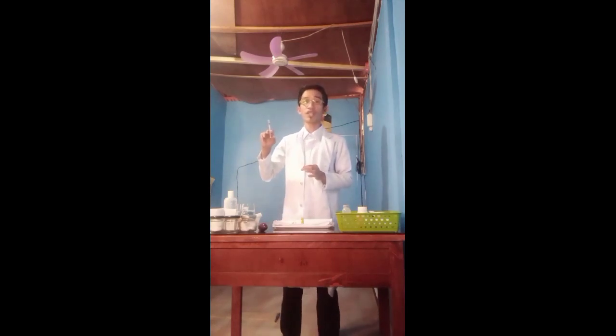This allows fluid to settle at the bottom of the barrel so it is not expelled. So next, if the syringe contains excess fluid, use the sink. Hold the syringe vertically with the needle tip slanted slightly toward the sink. Slowly eject excess fluid into the sink. Recheck the fluid level in the syringe by holding it vertically.